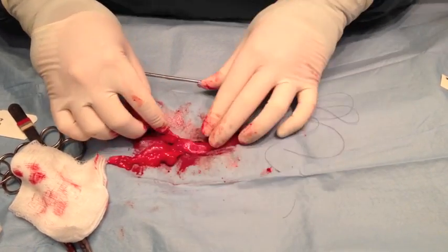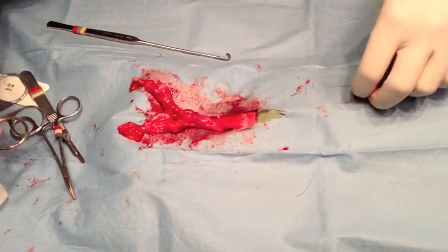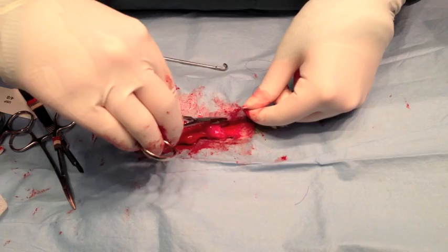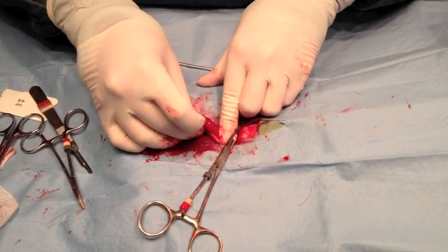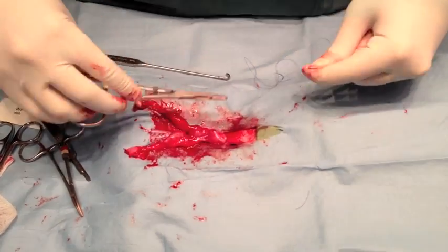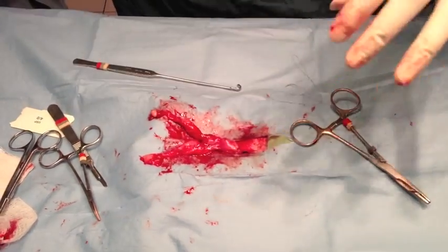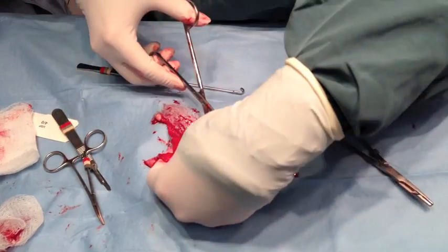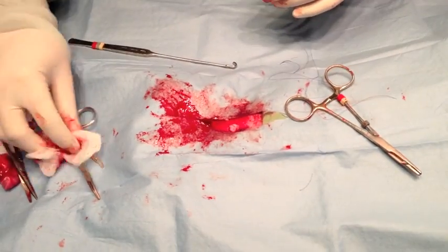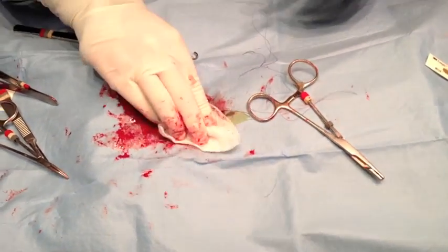Here I found what's called the vaginal vault. The rabbit has two cervices and two uterine horns — those two cervices come together in a vaginal vault. Prior to ligating, I milked any fluid — basically urine — out of that vaginal vault into the uterus so that it comes out of the rabbit and doesn't stay inside. I'm ligating around that; you can do it high or low — I usually like to do it right on the vaginal vault itself. Here I am cutting it away right above my ligature — so voila, the rabbit has now been spayed. All that's left is to close up.